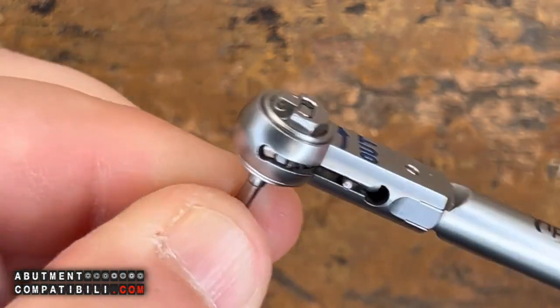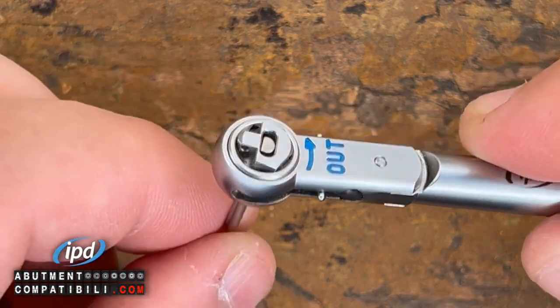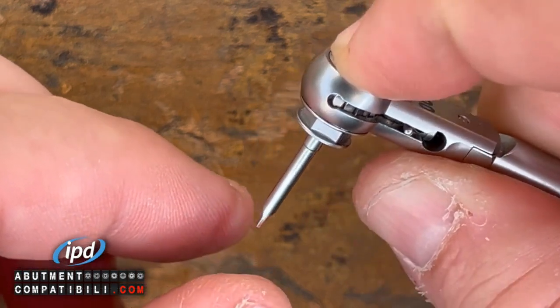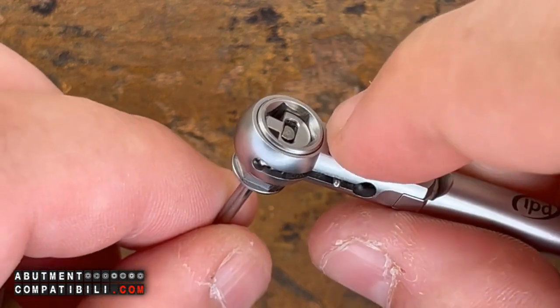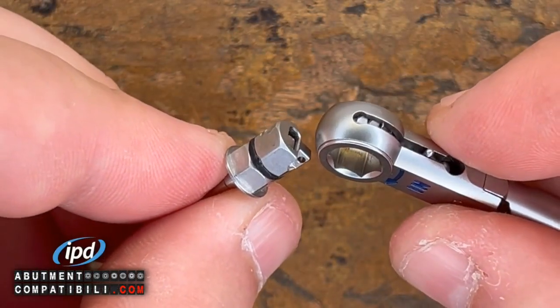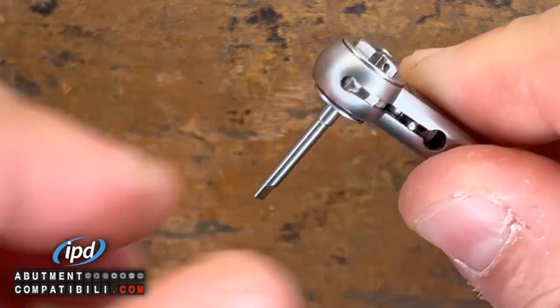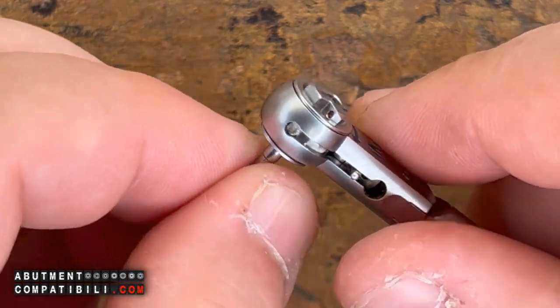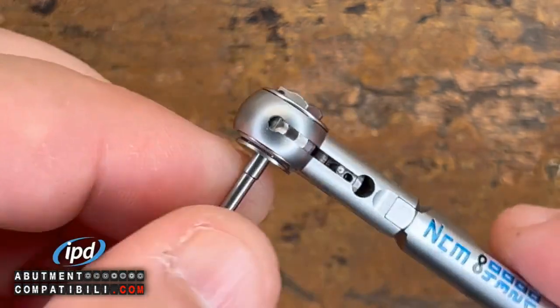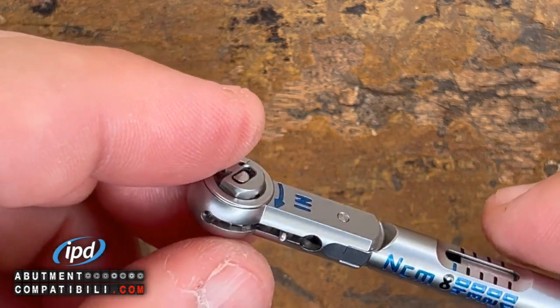To screw. If I want to make it work for unscrewing, I will exclusively extract the hexagonal part. So I push with my finger on this portion here, extract the pin — which is the insert — turn the ratchet, and insert my hexagon. At this moment, I am working in the opposite direction. So if it was screwing on one side, it is unscrewing on the other.